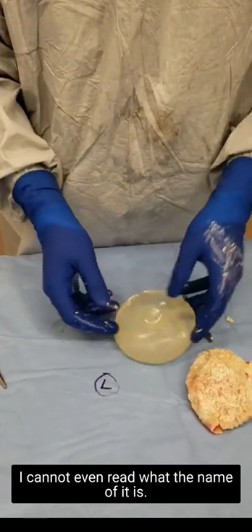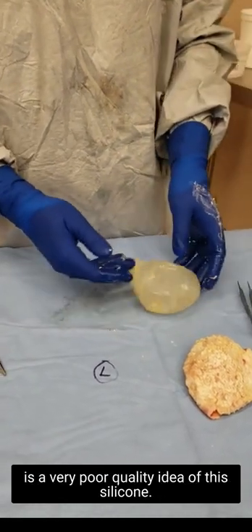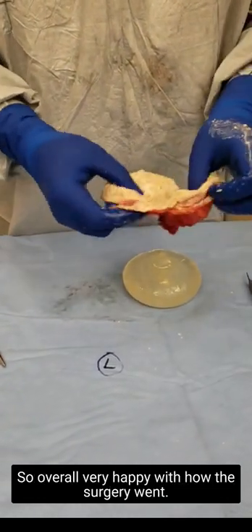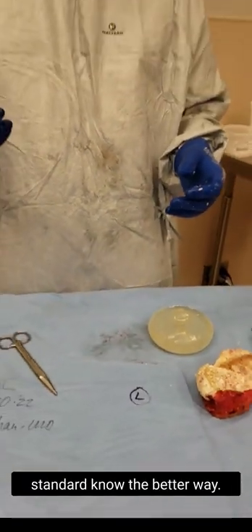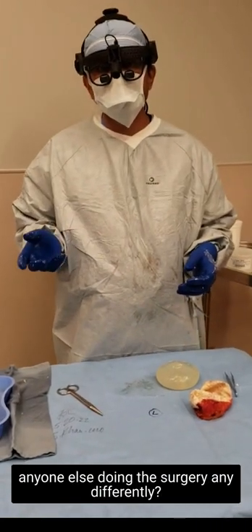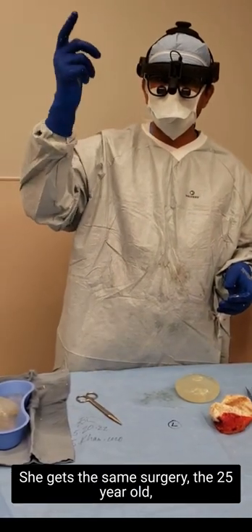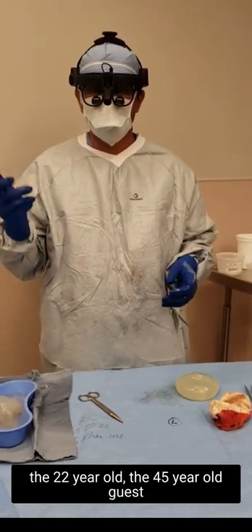Just by touching the wall you can see this is a very high quality capsule with the silicon. Overall very happy with how the surgery went — another en bloc, the gold standard. I cannot imagine 20 years from now anyone doing the surgery any differently. En bloc, the gold standard — no need for drains. A 68-year-old female gets the same surgery that the 25-year-old, the 22-year-old, the 45-year-old gets.